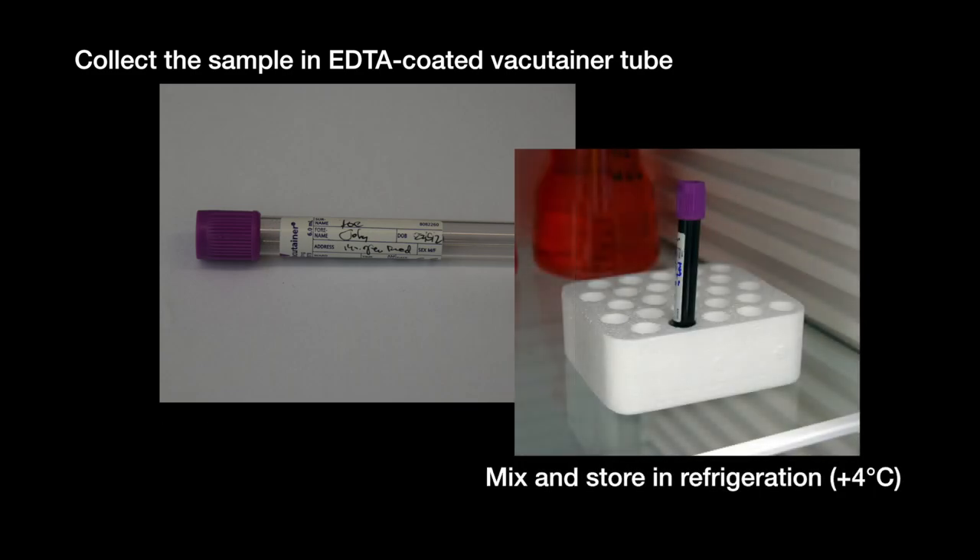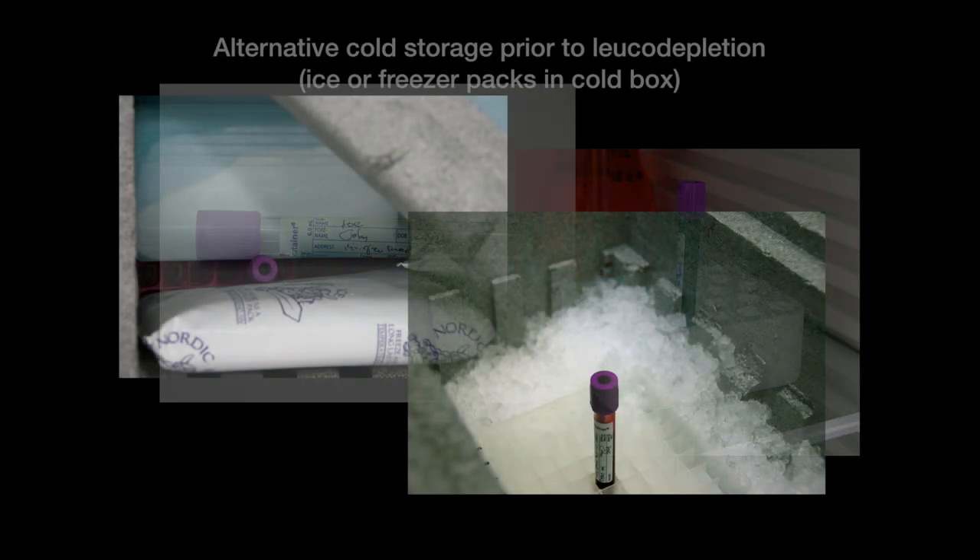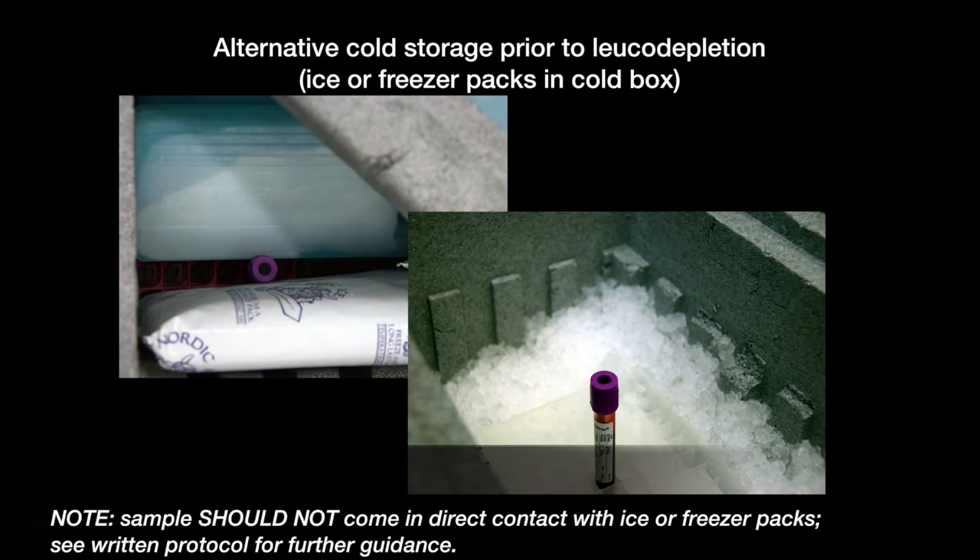Mix the collected blood sample by gently inverting the tube several times, and then store the sample in a refrigerator at 4 degrees Celsius. If a fridge isn't available, use ice packs to cool the sample until leukodepletion. Check the written protocol for further details on this procedure.